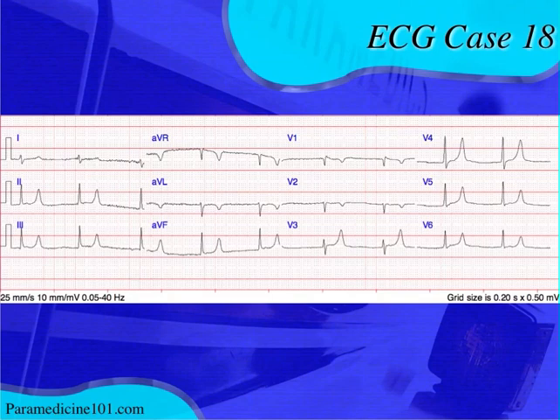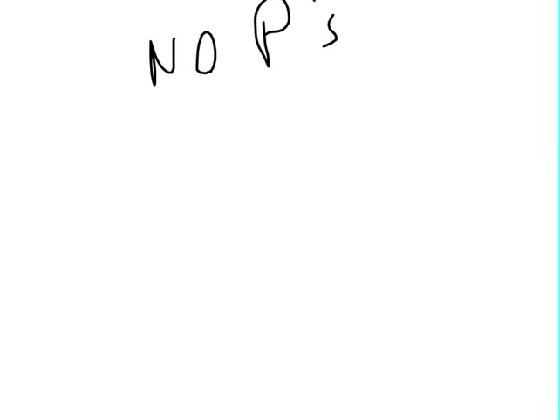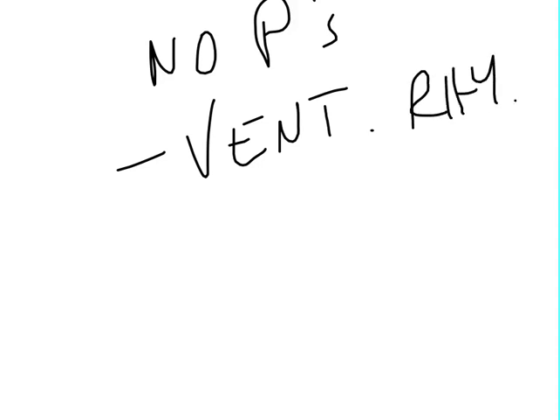If you take a look at this EKG, the first thing you want to look at is the rate and the rhythm — don't skip that. You may notice that you don't see P waves before the QRS complexes. Not seeing P waves before the QRS complexes can be concerning, so there are a few things in a differential I want you to consider when you don't see P waves. First thing you should consider: is it a ventricular rhythm? That should be at the very top of your list. When we look back at the EKG, you'll see the QRS is narrow, so it's not a ventricular arrhythmia.